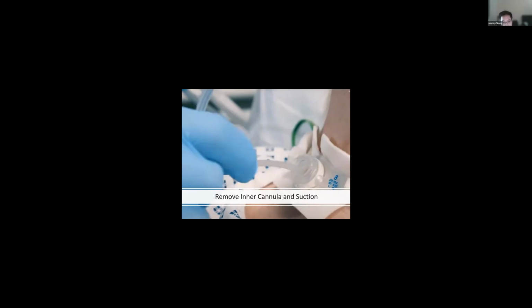But say you can't get the suction through, you get it through like a centimeter or two, but it gets some obstruction. You don't want to force it. You don't want to force it through. So this clearly means that there's some sort of blockage or obstruction or displacement.